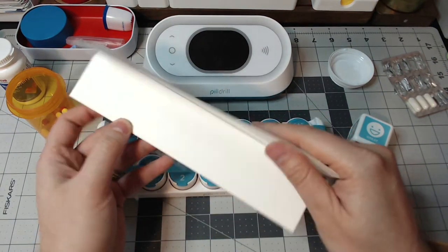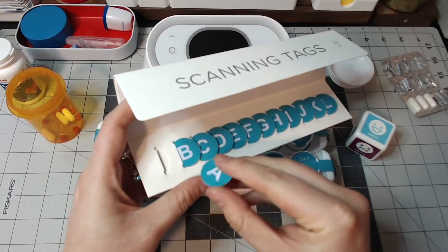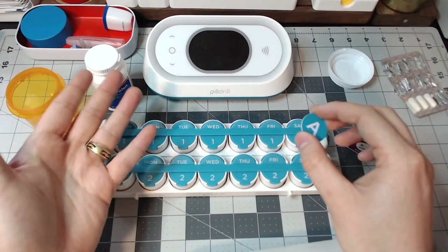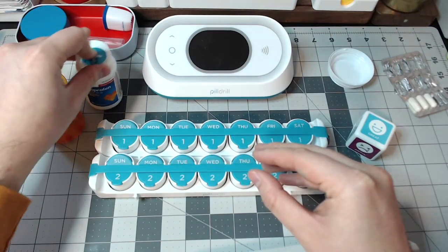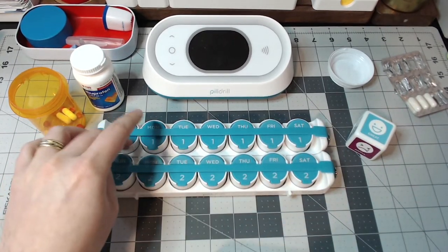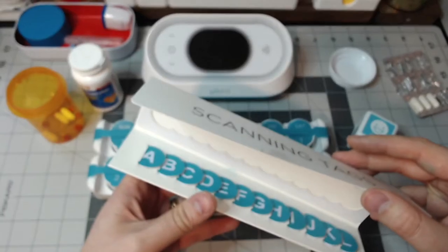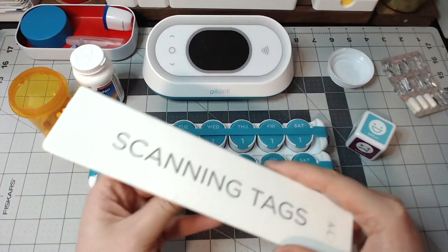The other thing shown is the scanning tags. These tags are stickers — why would you use them? Well, you might have a medication that you don't want to put in the pill tray. What would that be? Let's say it's ibuprofen. Most people don't take that on a scheduled basis — it's more of an as-needed or PRN medication. So you put the tag on the bottle, scan it, and then you know that's what you did. You have to set up the scanning tags through the app as well. The only issue is these stickers, once you put them on, you probably can't remove them, so that might be a drawback if you switch medications.